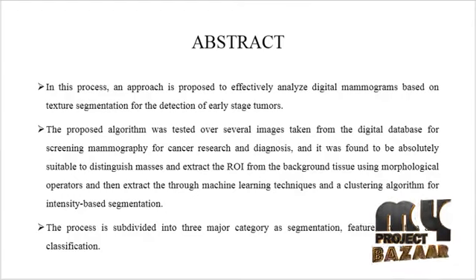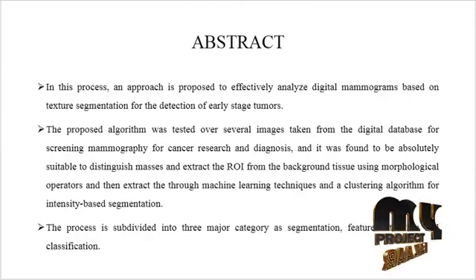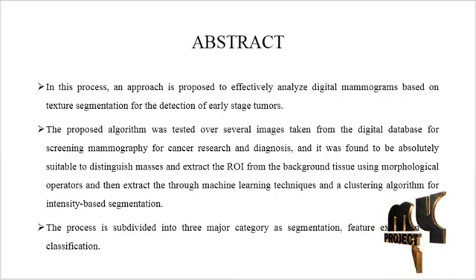In this process, an approach is proposed to effectively analyze the digital mammogram based on texture segmentation for the detection of early stage tumors. The proposed algorithm was tested over several images taken from the digital databases for screening mammograms for cancer research and diagnosis, and it was found to be suitable to distinguish the masses and to extract the region of interest from the background tissues by using morphological operators, and then extract features through machine learning techniques and clustering for the intensity based segmentation.